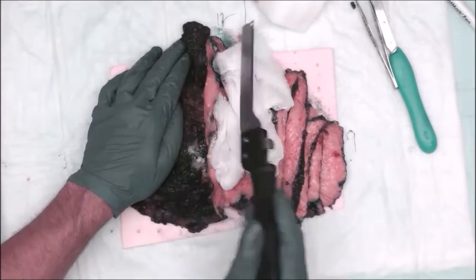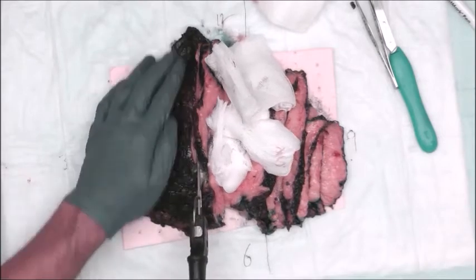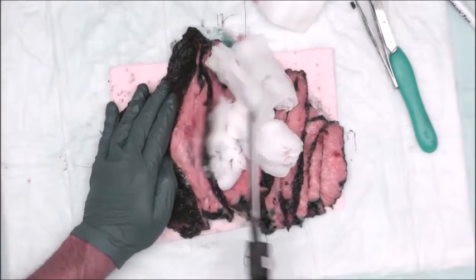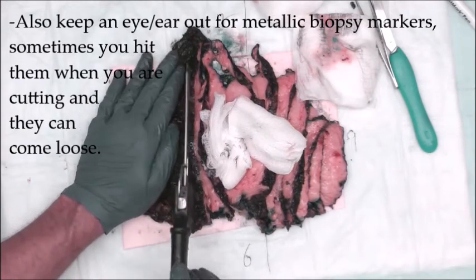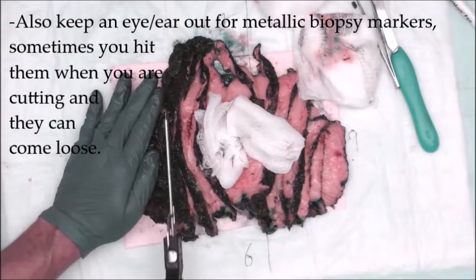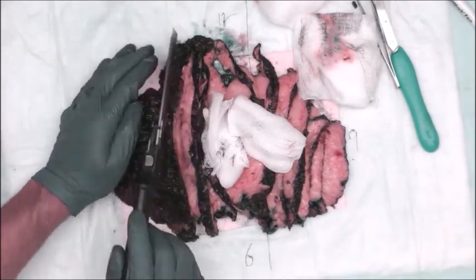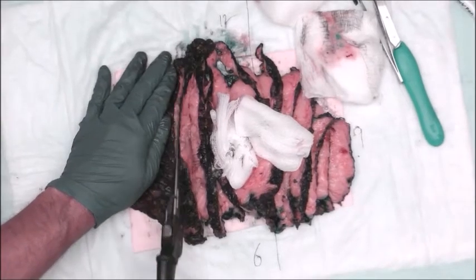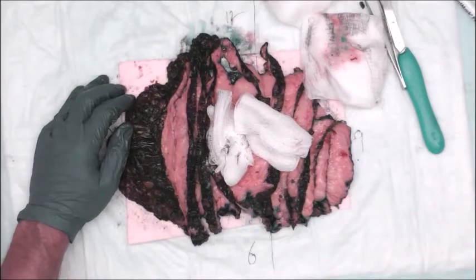Okay. Like I've done for other tumors. It's got a very mucoid, necrotic cut surface. Okay.